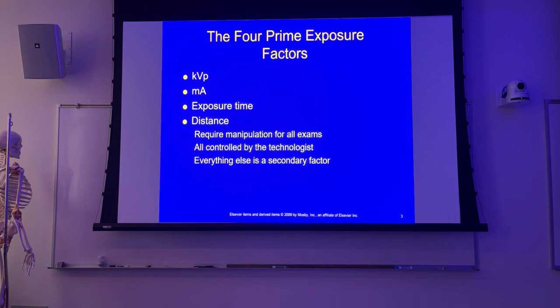All right, so remember, anytime we're talking about intensity, we're talking about numbers, right? So as intensity increases, numbers increase, be that mA, time, kVp, distance, whatever, just a count of photons. What that table shows is that in X-ray intensity, everything affects intensity.